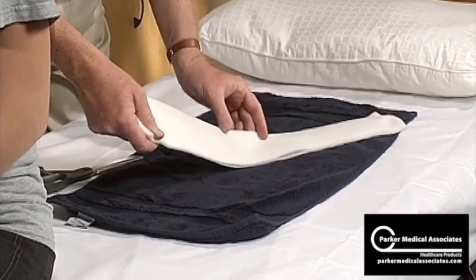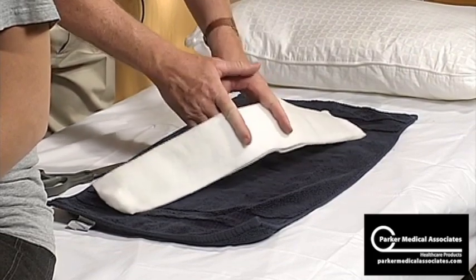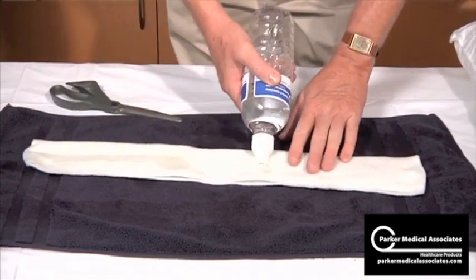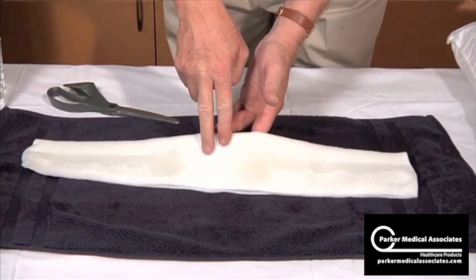That gives you this nice three-inch area of just padding only, which is going to go underneath the heel. Now just wetting the substrate on both sides, leaving the middle dry — that portion is going to be sitting on the heel, so keep it dry.